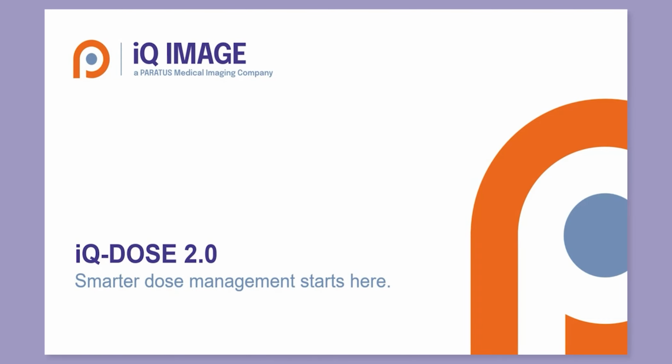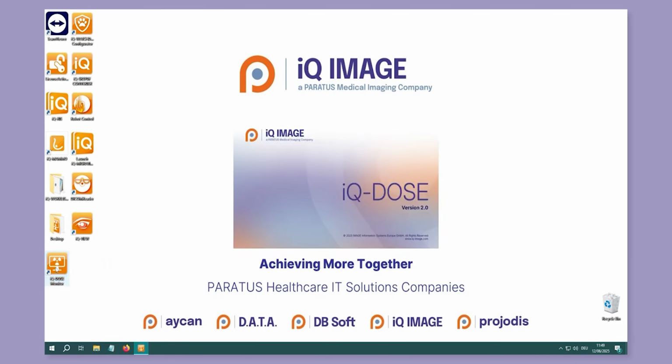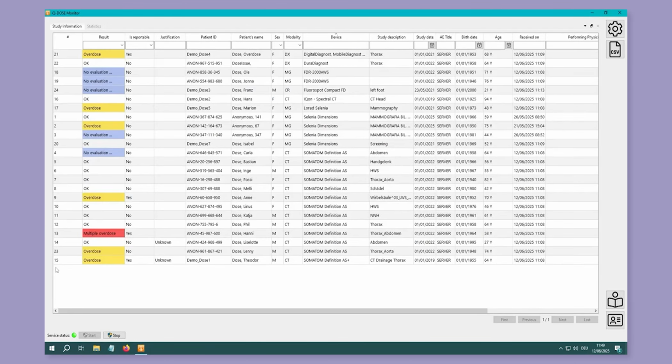In radiology, efficiency, safety, and transparency matter, especially when it comes to radiation dose. That's why there's iQ-DOSE 2.0, the next generation in dose management. With iQ-DOSE 2.0, you stay in control of your institution's dose data, visually, interactively, and with confidence.